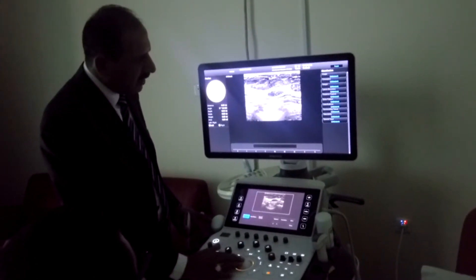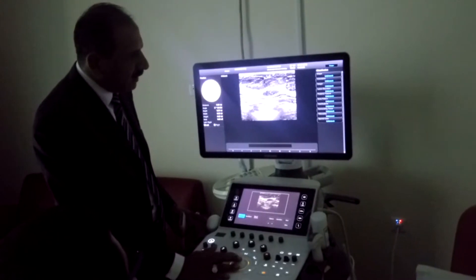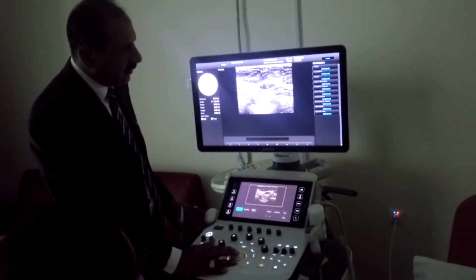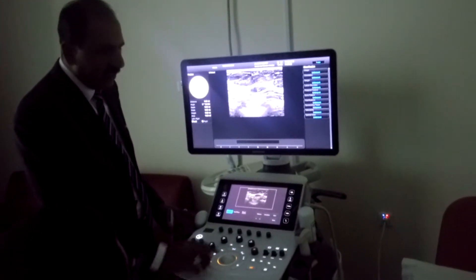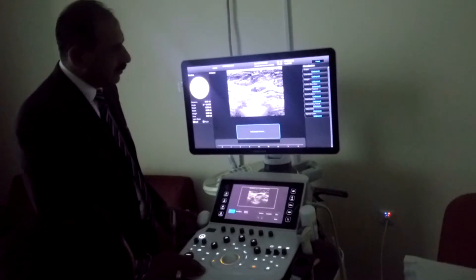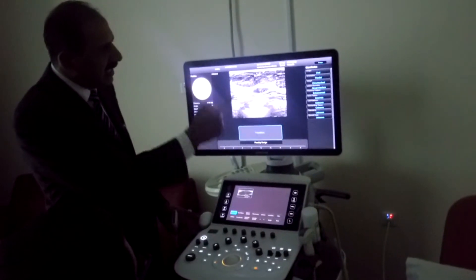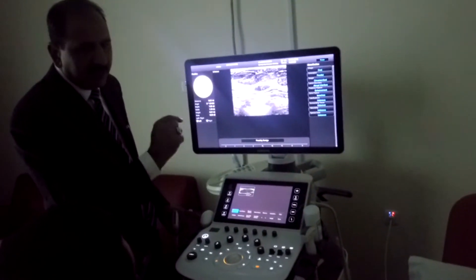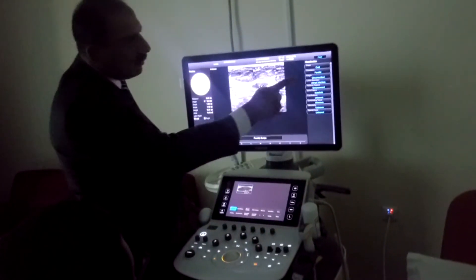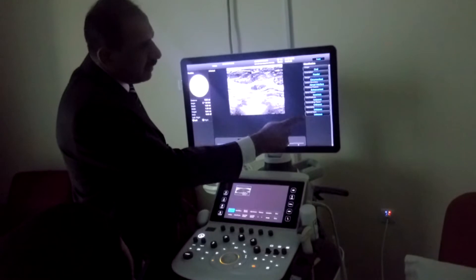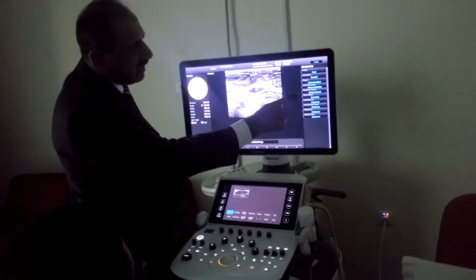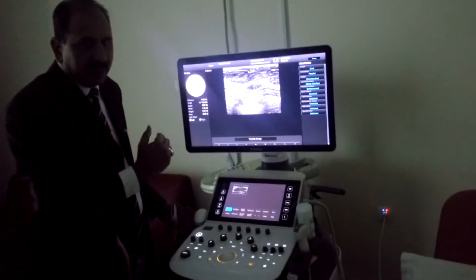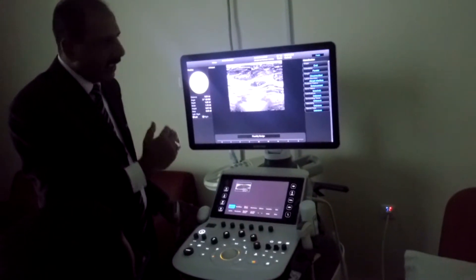So we have to provide this seed point. By cursor, you can move this one and bring it to the center. Just press now, set. Automatically, it will detect the borders, everything. So from here, after six parameters, it will detect automatically.